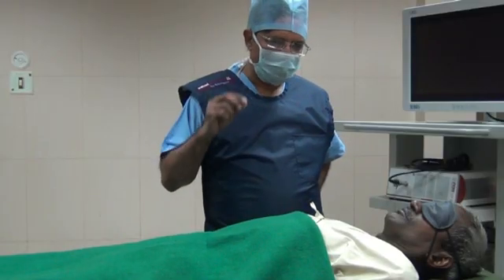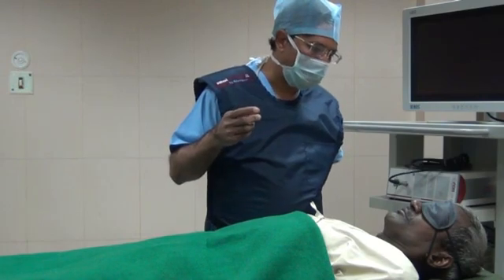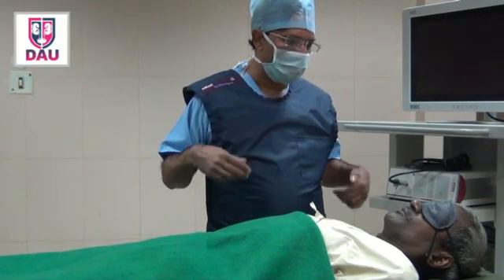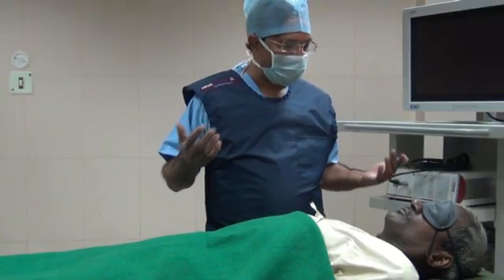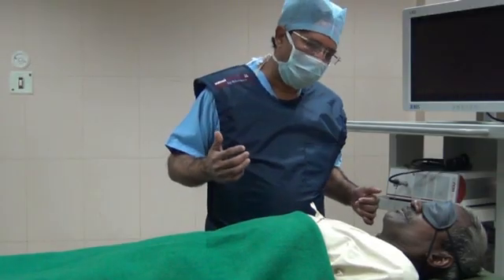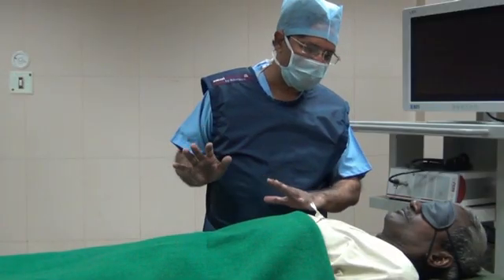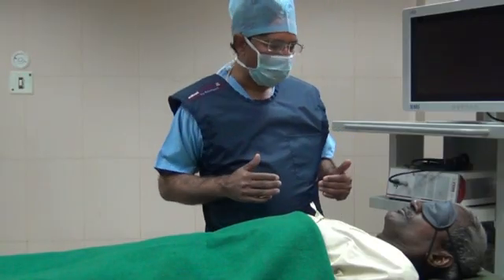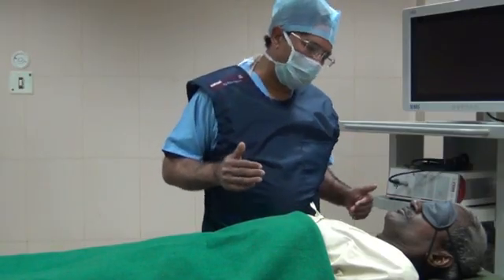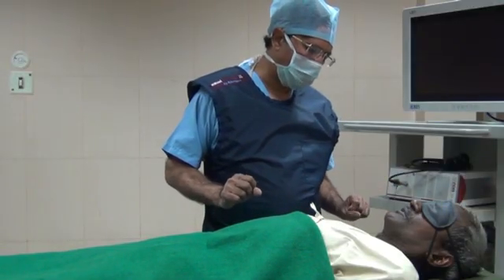Another thing is that during the procedure, I might ask you to take a deep breath, right? Take a deep breath in, take a deep breath out. Okay? So just bear with me, take a deep breath in and a deep breath out. I might also ask you to relax your thigh muscles and abdominal muscles and feel comfortable. So you will need to cooperate with me during the test. I can rest assured there will be no pain, no discomfort and no problem. Right?